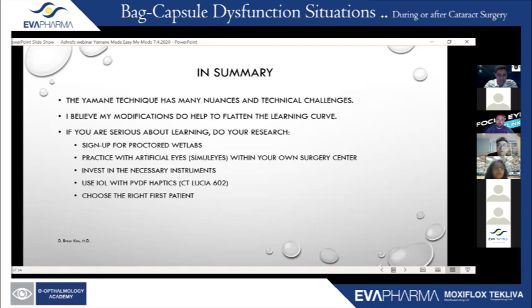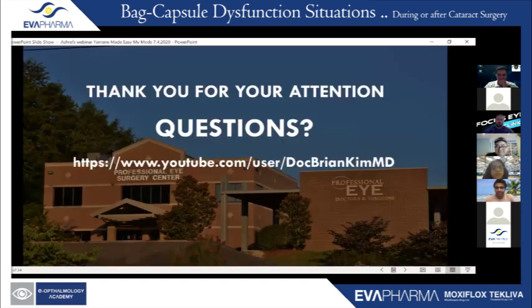And so I think the glued IOL is really an excellent technique. In my hands, using the stronger haptics is really very, very beneficial. And lastly, choose the right first patient. And I wish you all the best. Thank you so much for having me.